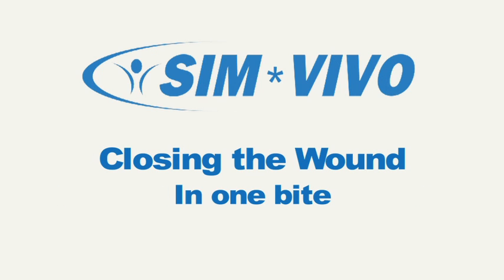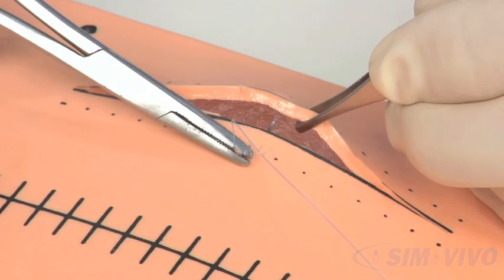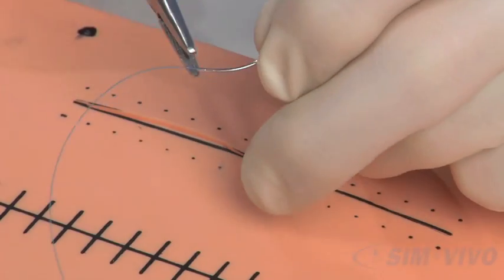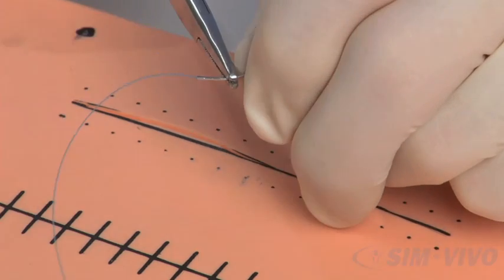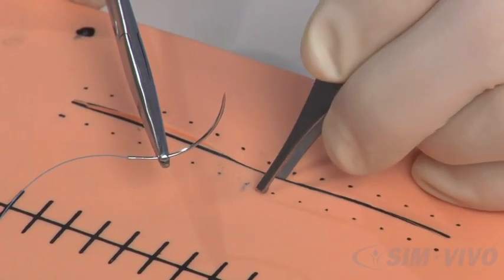For loose skin that comes together easily, it is possible to place a suture through both sides of the incision without removing it halfway through. We call this using one bite. In order to do this suture in one bite, first thing we need to do is load the needle perpendicular into the needle driver 2/3 of the way down.